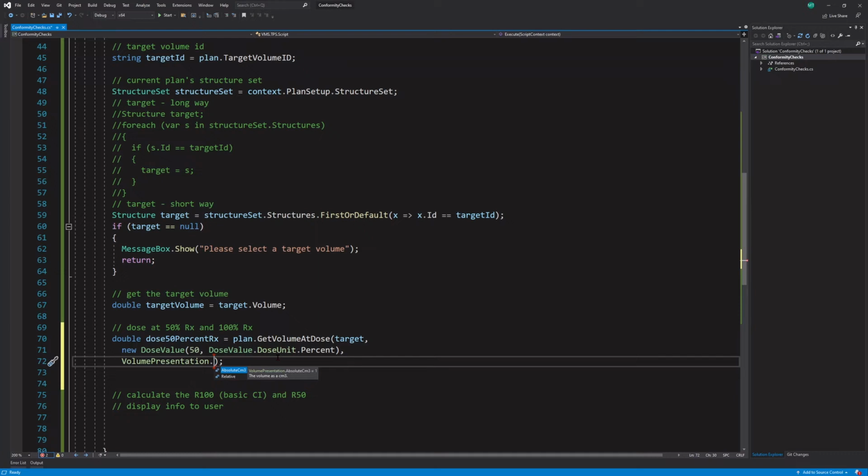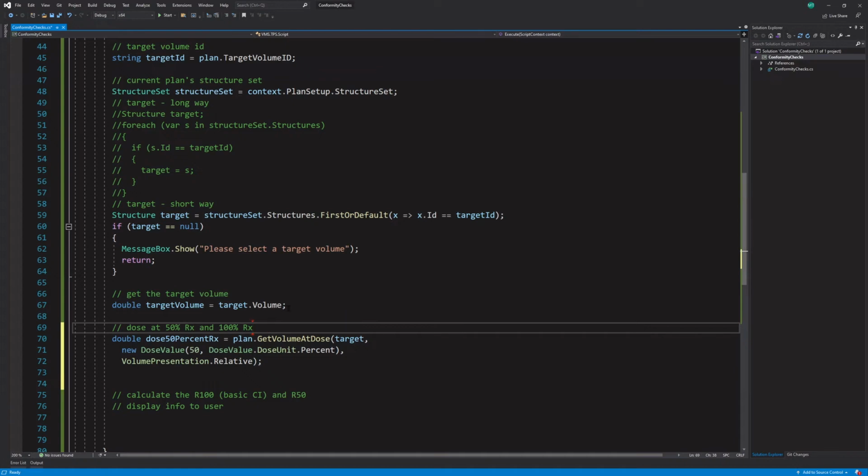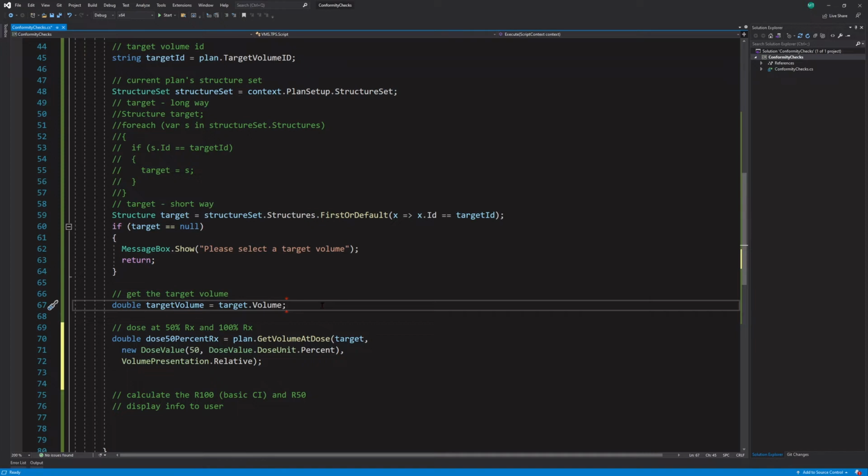So let's see, we need the dose at volume. Well, really the volume presentation doesn't matter. We're not returning that. We're returning the dose. And we want, let's see, this is going to be, you know what? We don't know. I guess it doesn't really matter. No, we want the volume at dose. So what volume do we want? We want absolute volume, duh. So let's do that. We want absolute volume, okay?